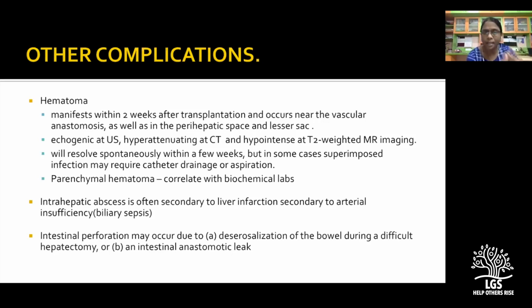If there is a hematoma and a clinically significant drop in the hemoglobin, we proceed with the CT to find out the site of bleed and whether there is an active bleed or not, and to quantify the hematoma. And the parenchyma should also be screened for any altered echogenicity and for focal lesions like an abscess or an infarct or a hematoma.